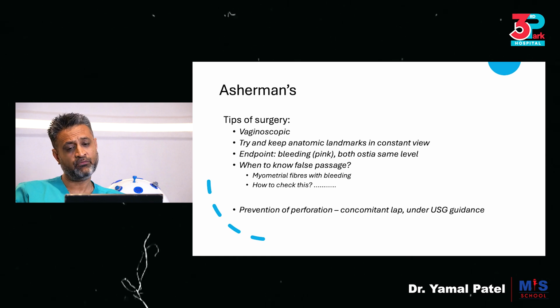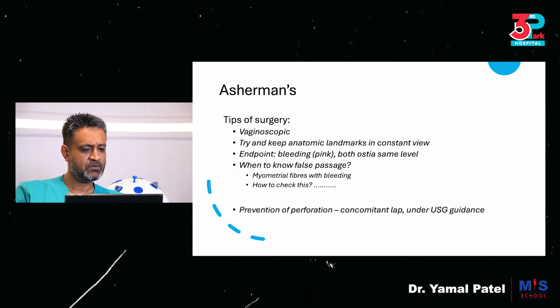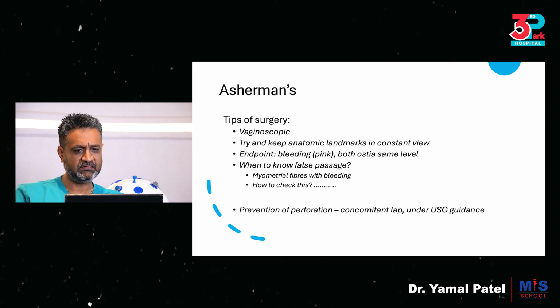Prevent perforation, how would you do it? Well, you can use concomitant lap in a double setup or do it under ultrasound guidance. So these are the tips of Asherman's.